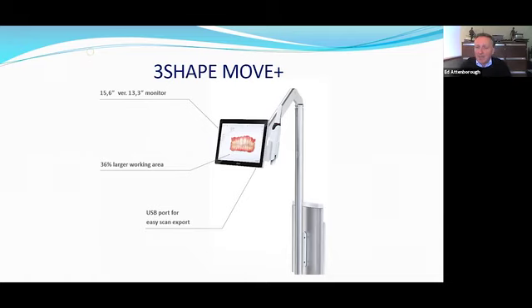So I think probably integrated solutions that are easy to sterilize and keep clean are probably going to be more popular in time to come. But of course, obviously with a laptop, it's very flexible. You can just plug it in and it's easy. But your laptop does have to be matched in terms of specification to the manufacturer's requirements for the wand hardware. So you can't just go and buy a wand and then buy a laptop from Dell or eBay and plug it in. It just won't work. They have to be really well matched together. So integrated solutions, I think, are probably going to become more popular.